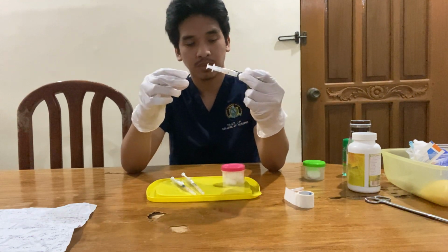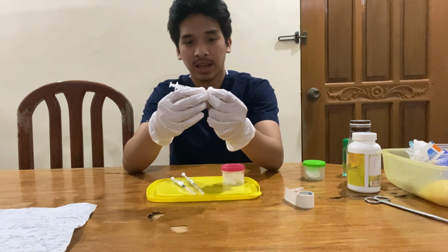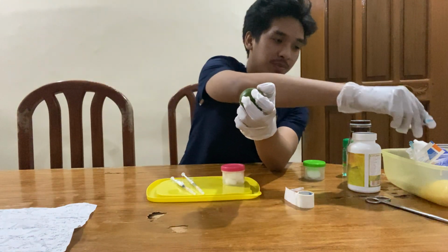Okay, once this is done, wait for 5 to 10 seconds again, and slowly remove the needle.